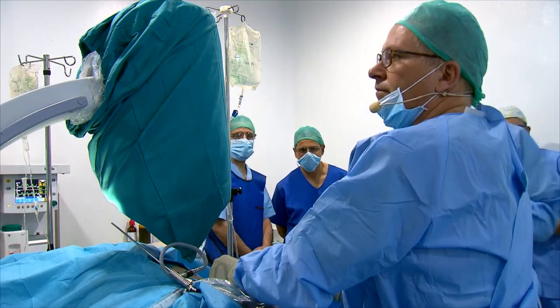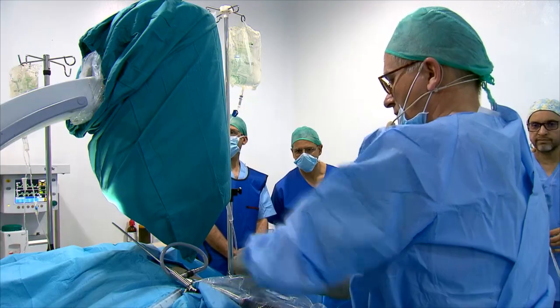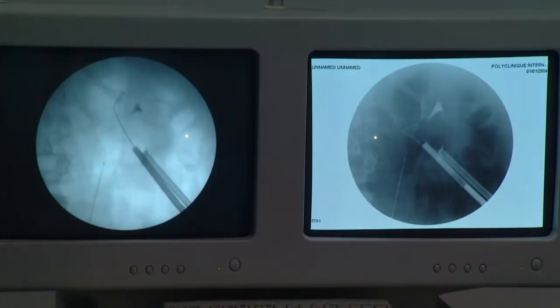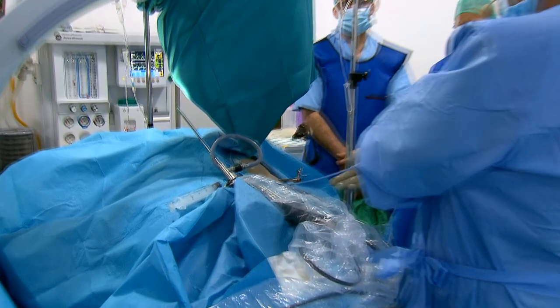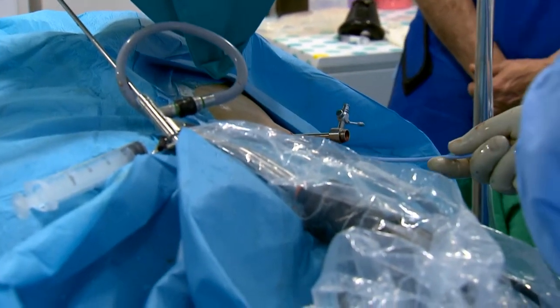X-ray. Caméra, montrez-nous les manœuvres externes, les manœuvres sur le malade. La vue externe de ses mains. Now we are inserting the nephrostomy tube through the lower pole. Merci, monsieur caméra. Okay, X-ray, please.